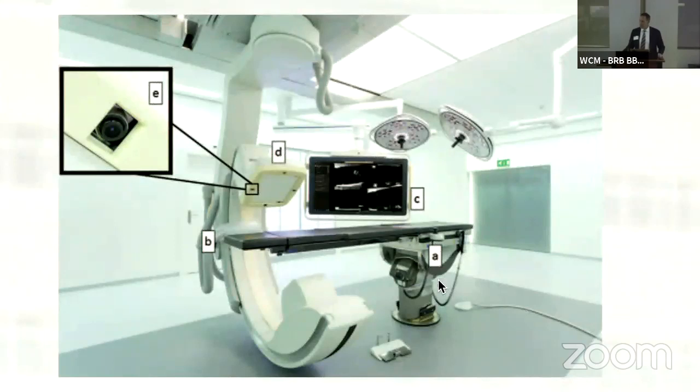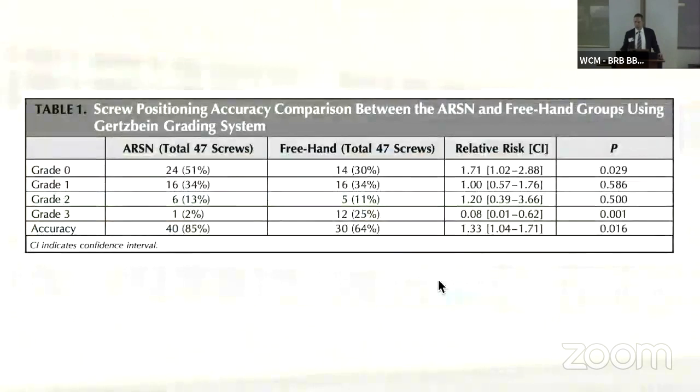The camera is mounted directly on the image intensifier, and then there's a remote screen whereby you can capture the augmented overlay onto a real view of the surgical site. They've done a cadaver study, and I believe they also have clinical studies that they'll talk more about, comparing the freehand technology to this augmented reality system with a significant improvement using the augmented reality system.